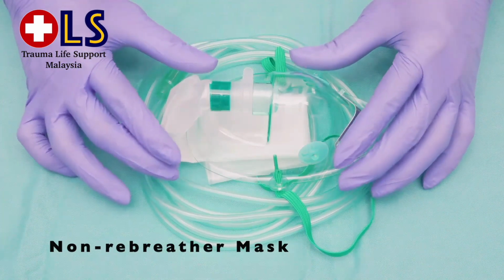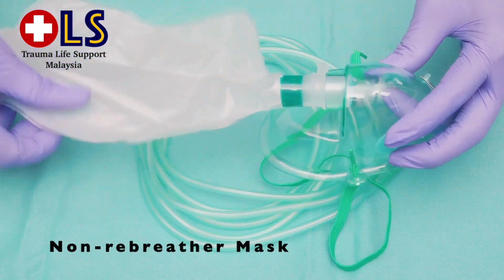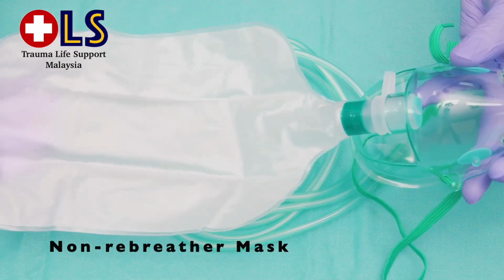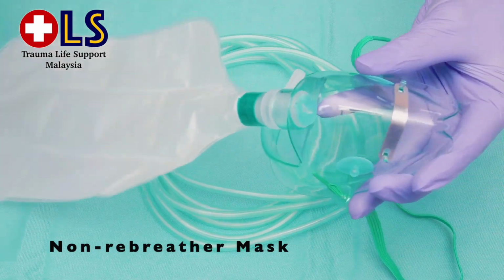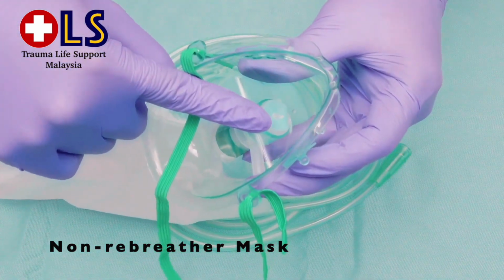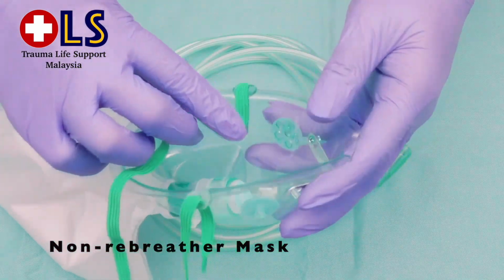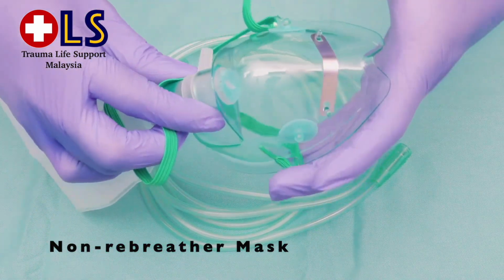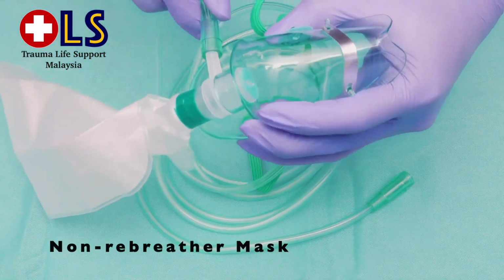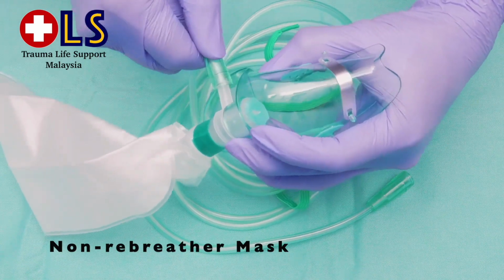This is a non-rebreather mask, or known as high flow mask, which can deliver high fraction of oxygen in spontaneously breathing patients. There is a reservoir bag attached to the fresh gas flow with one-way valve between the reservoir bag and the patient. This is to prevent expired gas entering the reservoir bag. It delivers FiO2 between 0.6 to 0.9 or 60% to 90%. Assemble the equipment and attach it to the oxygen supply. Ensure that the reservoir is expanded with flow preferably 10 to 15 liters per minute.